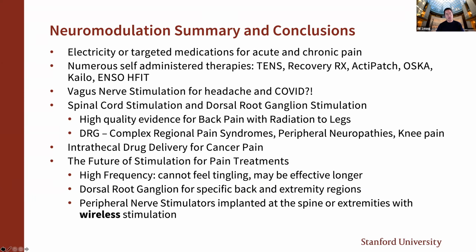Spinal cord stimulation and DRG stimulation, they have great evidence for back and leg pain and complex regional pain syndromes, but we're starting to expand it to other peripheral neuropathies, knee pains, and other kinds of pain conditions, and getting more and more data all the time for it. Intrathecal drug delivery system, especially for cancer pain patients, very, very effective. Also for non-cancer too, when other forms of neurostimulation are not working.